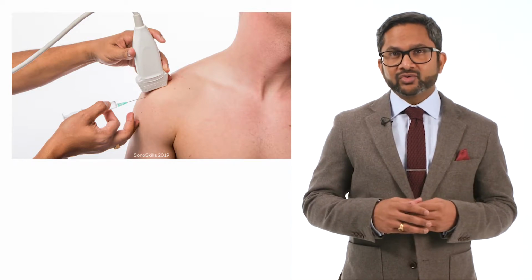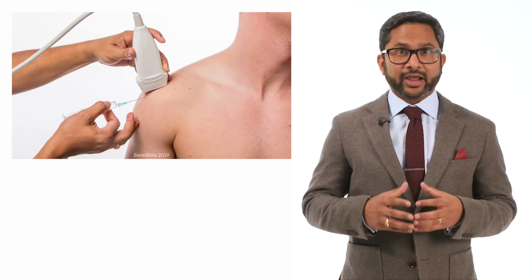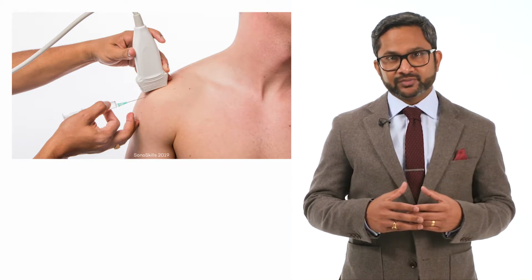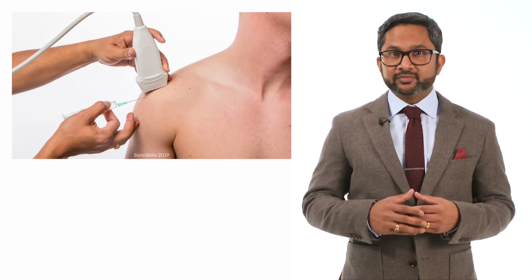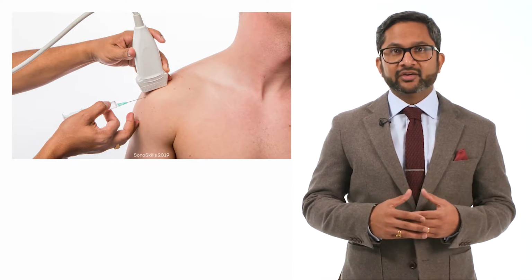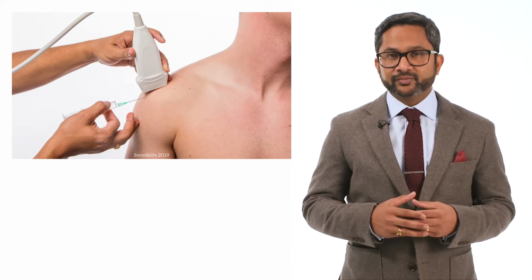Furthermore, ultrasound guidance enables the clinician to identify the target structure for aspiration or injection with improved accuracy compared to conventional landmark-based procedures. Ultrasound-guided injections are also considered to increase patient safety and minimize discomfort and complications. Examples of ultrasound-guided interventions include injections, aspirations, and barbotage.